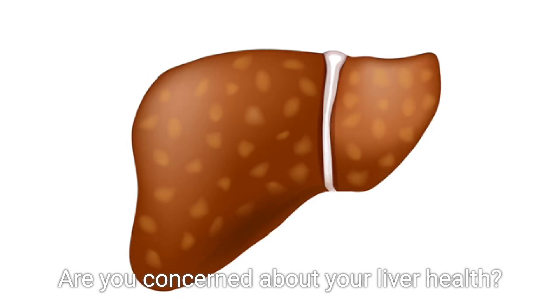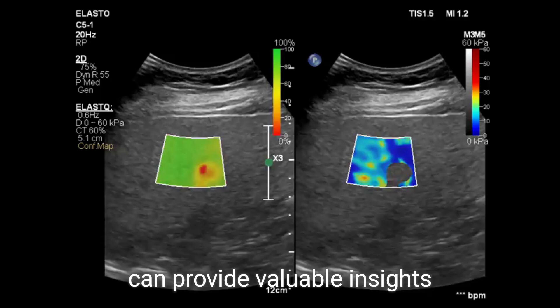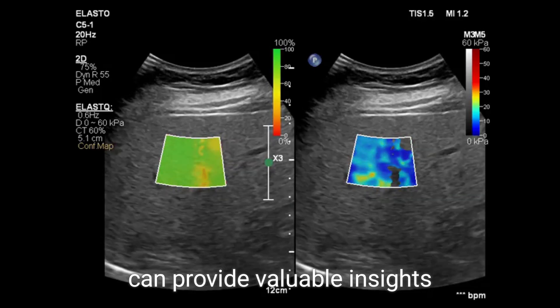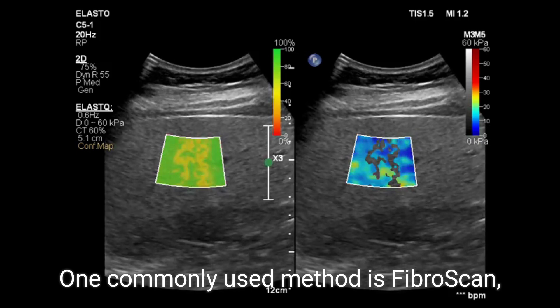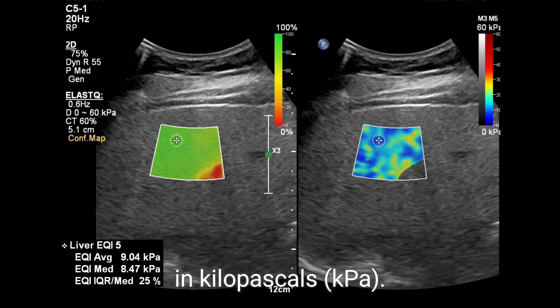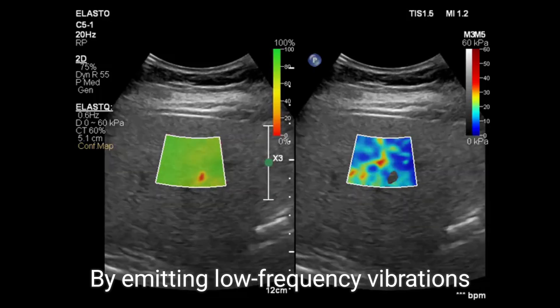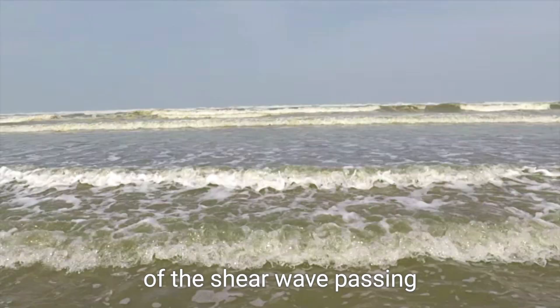Are you concerned about your liver health? Elastography, a non-invasive imaging technique, can provide valuable insights into liver fibrosis. One commonly used method is Fibroscan, which measures liver stiffness in kilopascals (kPa) by emitting low-frequency vibrations into the liver.